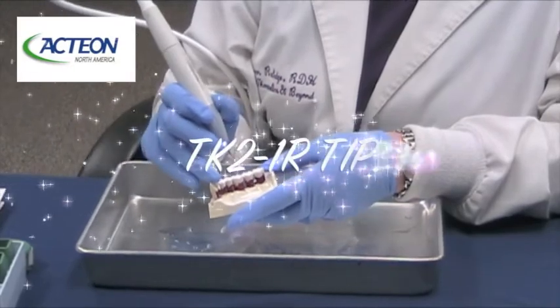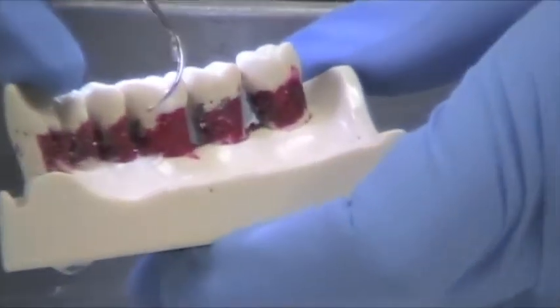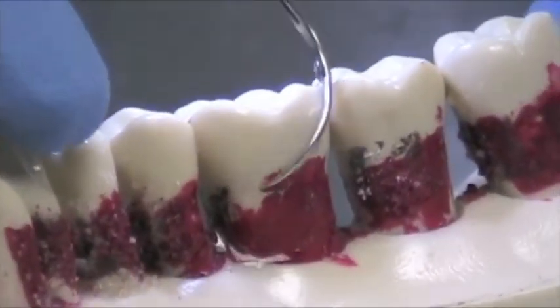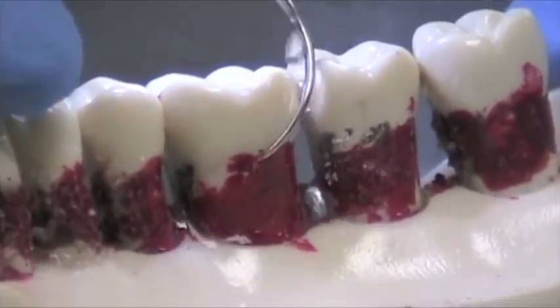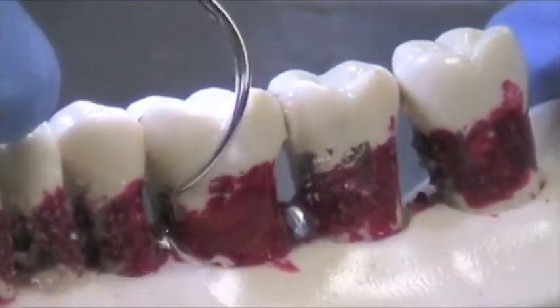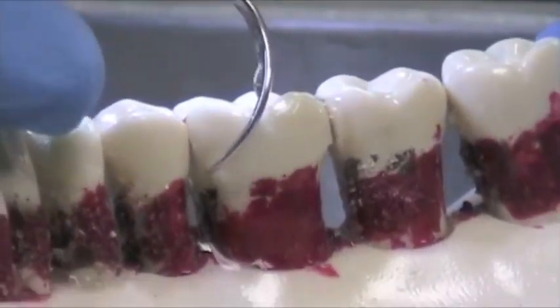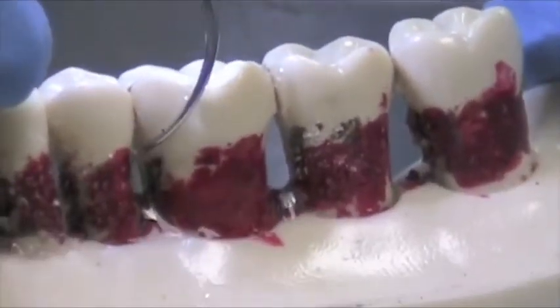Now I'm going to demonstrate the TK-2-1R. This tip is for posterior teeth for biofilm debridement. Again, we're going very lightly — feather light touch. This tip looks like a Nabers probe, and if there was a furcation here, that tip could just slip right into the furcation and get to the base or bottom of the furcation and clean that out very well. Something an instrument couldn't do, because we have the benefit of cavitation and lavage. Remember, this is non-bladed and not diamond coated.